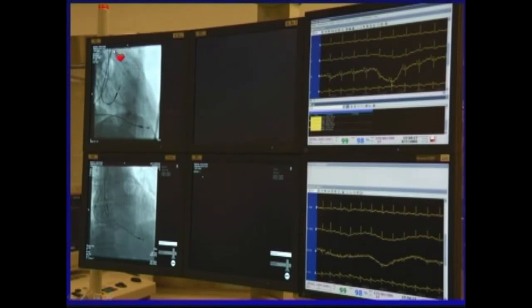With this X-ray monitoring, we can monitor where the lead goes. We also monitor the ECG of the patient when we test the pacing threshold of the patient.